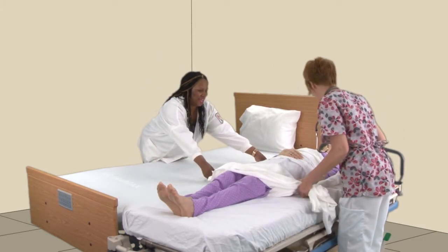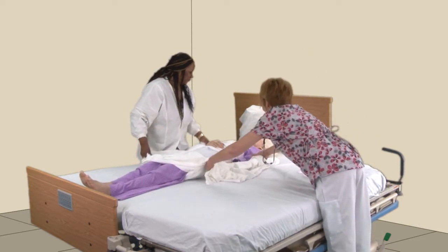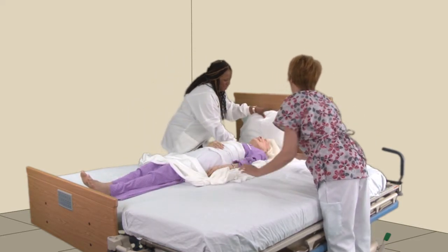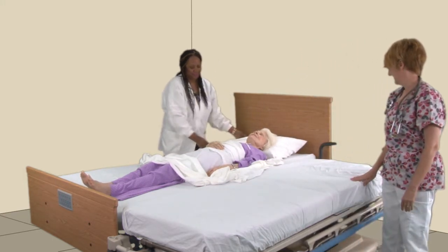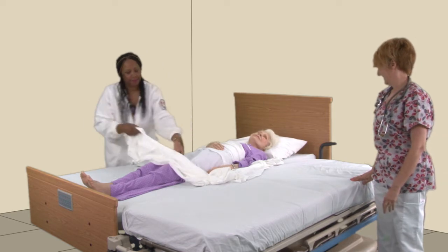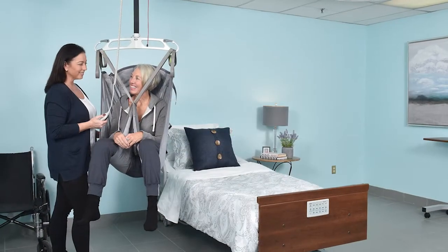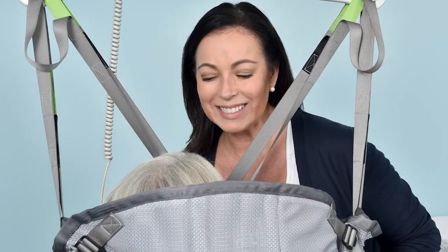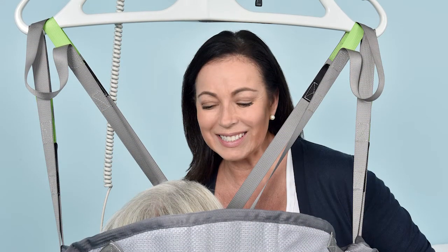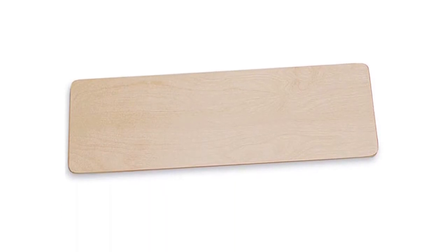However, if a lift is not available, healthcare workers should use good body mechanics and moving methods to transfer patients from stretcher to bed and bed to stretcher. Consider patient safety when moving patients from one surface to another. Be sure to lock wheels on both surfaces. Use good body mechanics and a lift system if available to reduce shear injuries to patients and back injuries to caregivers. Use transfer boards when possible.